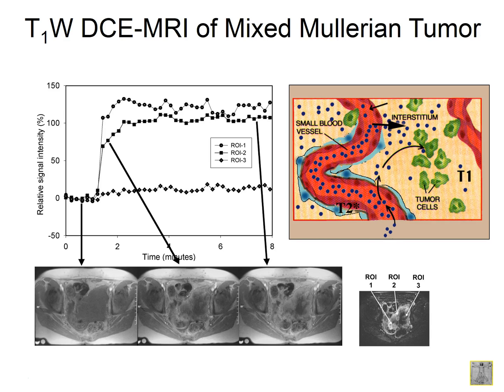The T1 experiment, as we said, reflects the delivery of the contrast medium to the vascular space and then the leakage of the contrast agent into the extracellular space, where the dilute contrast causes this enhancement in the time signal intensity curves that you're able to see.